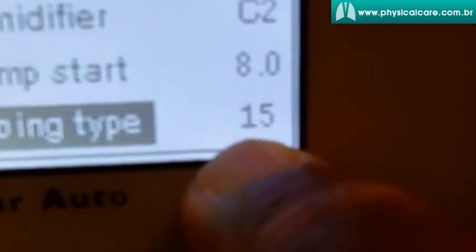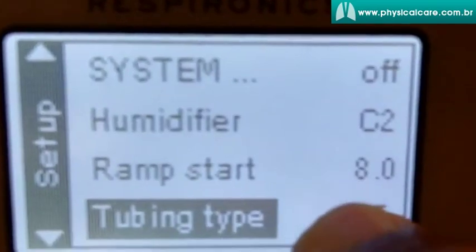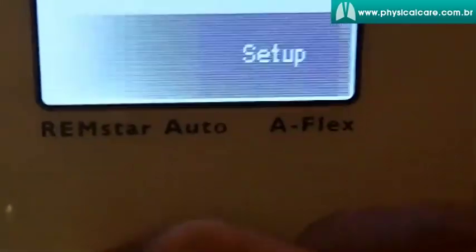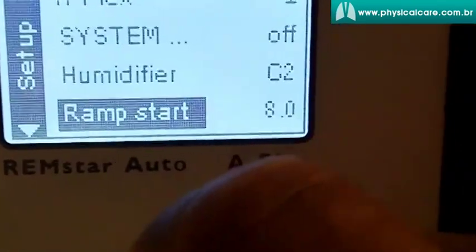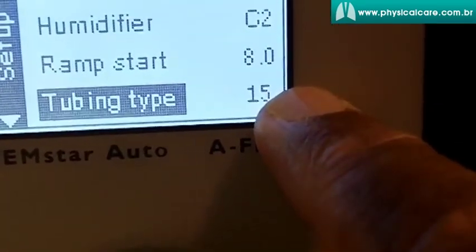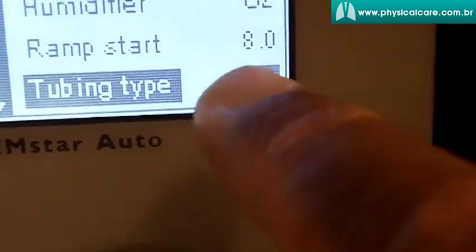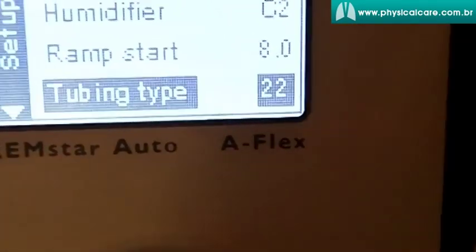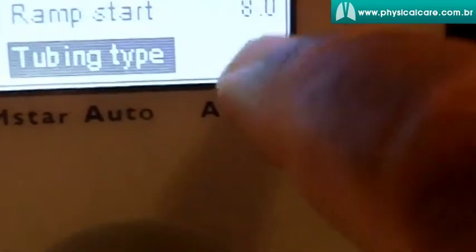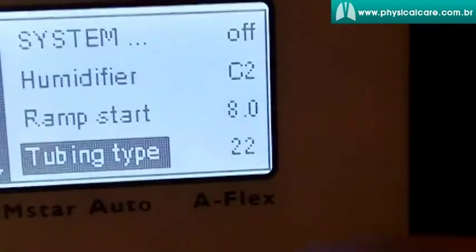Tubing type — you must register it. Respironics, in competing with ResMed, gives you a slimline tubing at 15 millimeter diameter. ResMed has also come up with their own version — a 15 millimeter diameter tubing — and you must register it. Otherwise, if you're using the standard performance tubing, you should set it to 22. Please do that, because it does affect how you feel and the performance of the whole system. The tubing that comes with this unit is the standard 22 millimeter tubing.